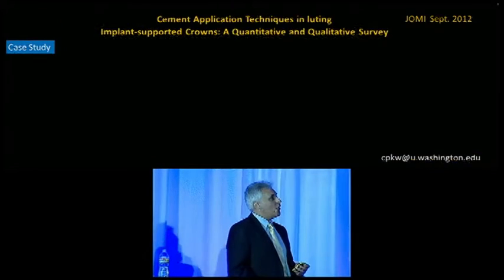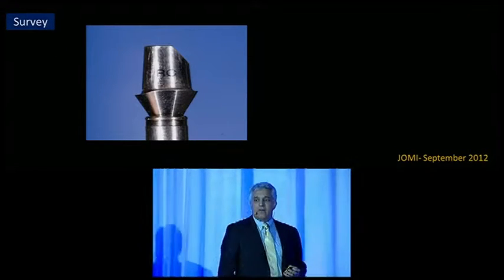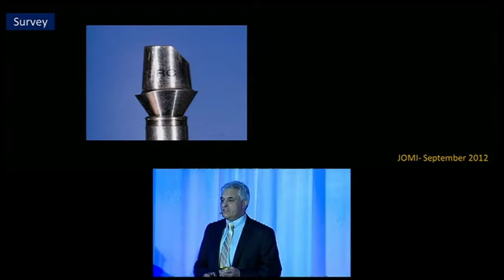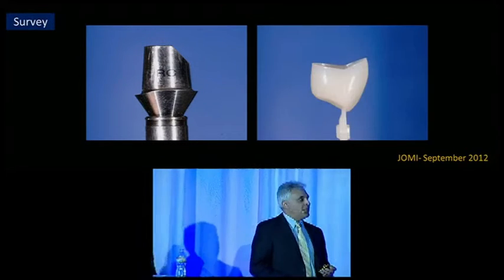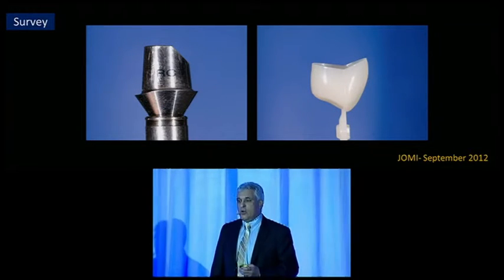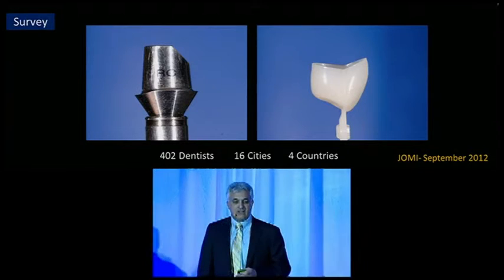So we would talk to audiences like you. Before we started our rhetoric, we would play a PowerPoint with audio, and we would show the audience an abutment. We'd say, what we'd like you to do is imagine this abutment is in one of your patients' mouths, in your office. You've got a crown, and you're going to cement this crown onto this abutment. We're going to provide you with some instruments and some tools.